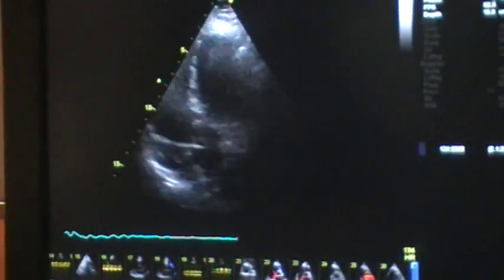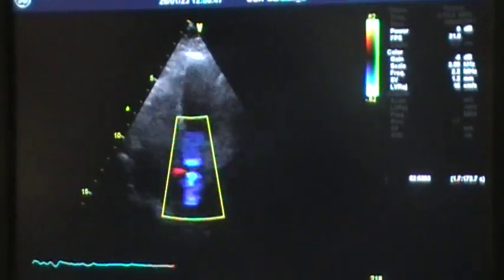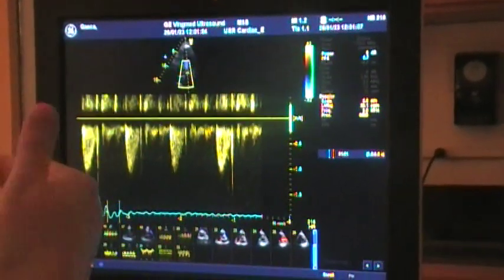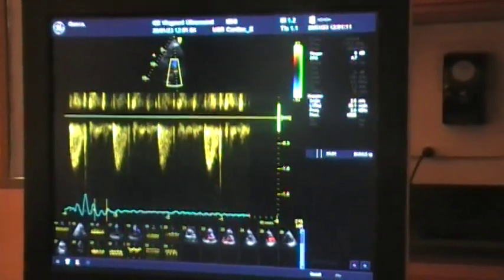So in that same picture, you're going to put your color back on. We're still on our aorta there in the middle. You want to be good and parallel to this flow to get your most accurate velocity. It's very important on this picture. So here's our aorta going out. We're going to do continuous wave now because we want to know what the highest flow through the valve is. The other was LVOT just before the valve. This is through the whole valve.